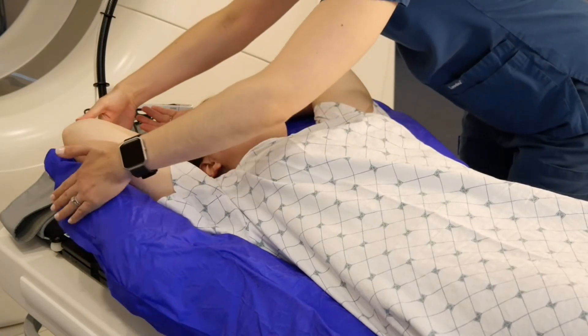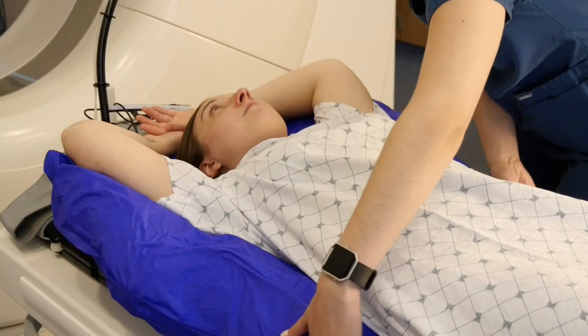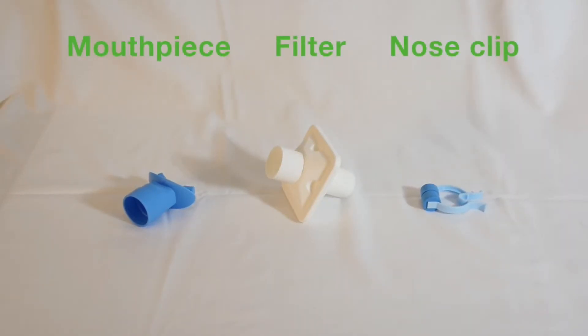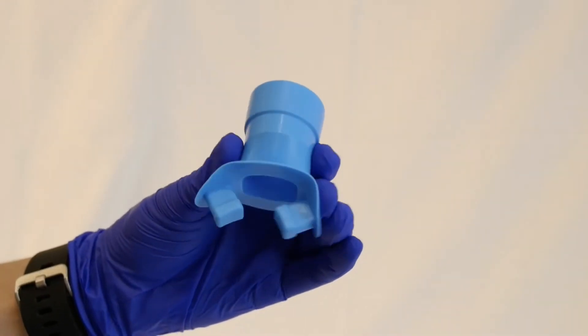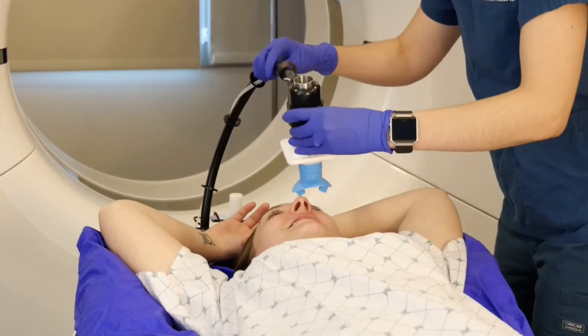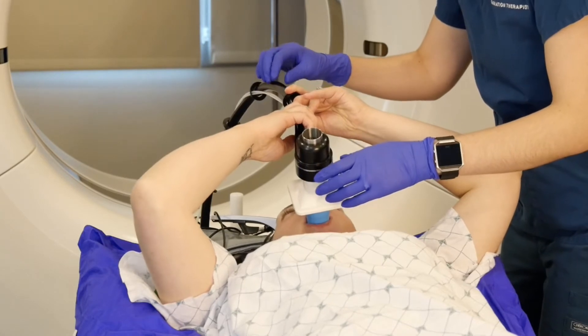This bag will form a mold, helping to hold your body in the same setup or position for each treatment that was done for your simulation. The therapist will then show you other parts of the SDX system: the mouthpiece, the bacterial filter, and the nose clip. The mouthpiece looks like a swimming snorkel or a scuba mouthpiece and is made of soft rubber. You will be asked to place the mouthpiece in your mouth so that it forms a seal and allows your breathing to only occur through the mouth.